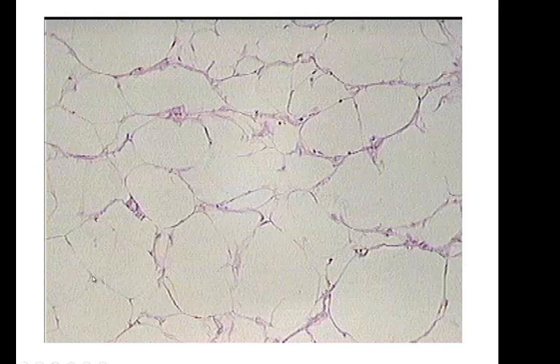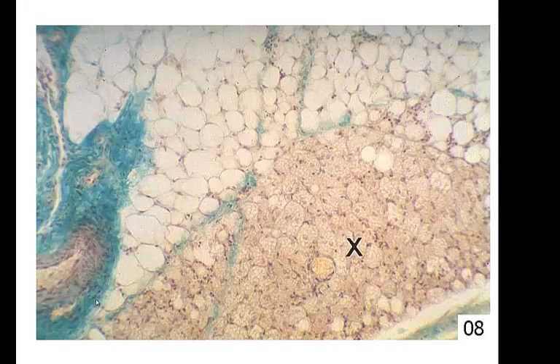And here's another slide of fat. It's kind of boring, isn't it? So this is adipose tissue. And that's just what it looks like. It looks like air bubbles coming off the end of a little air bubble wand. On this slide, can you locate where you can see the fat?